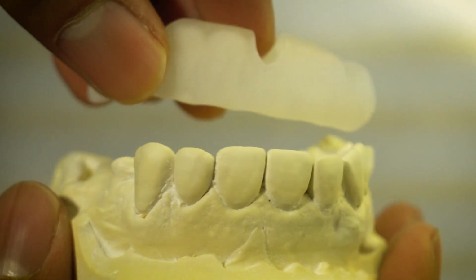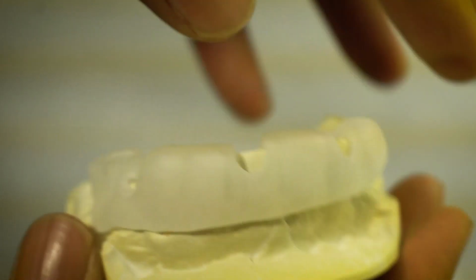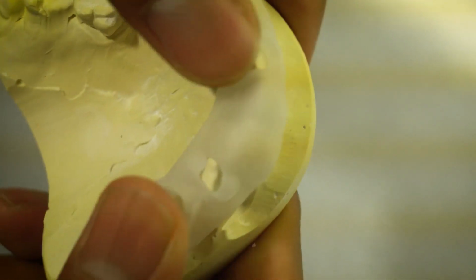Then they will take the CT scan where we've placed our implant, they will take the STL file and they'll merge them together, and from that information we can then 3D print a little plastic guide which sits on top of your teeth and has this little hole in it, and because it's sitting on teeth, there's no movement. You see, if a guide was sitting on gum, you could move it a little bit and that would introduce error. Whereas if it's sitting on teeth, you can actually be very accurate with the implant placement.